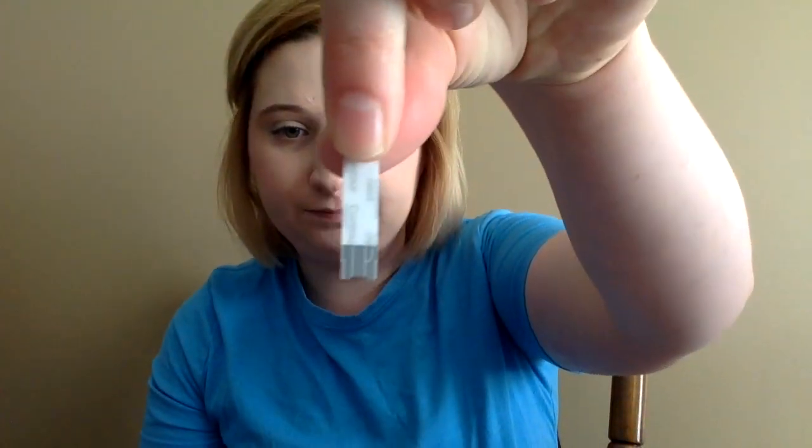Okay. Take a different hand. Wipe it off. And if you guys aren't familiar with the Contour Next One, it is quite thin. This is what it looks like. If you compare it with this one, big difference. Okay. This is what the strips look like for Contour Next.